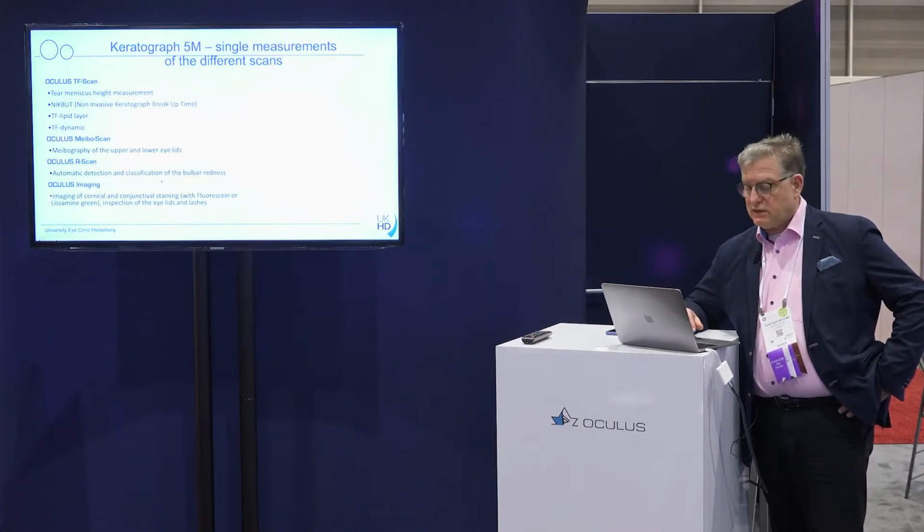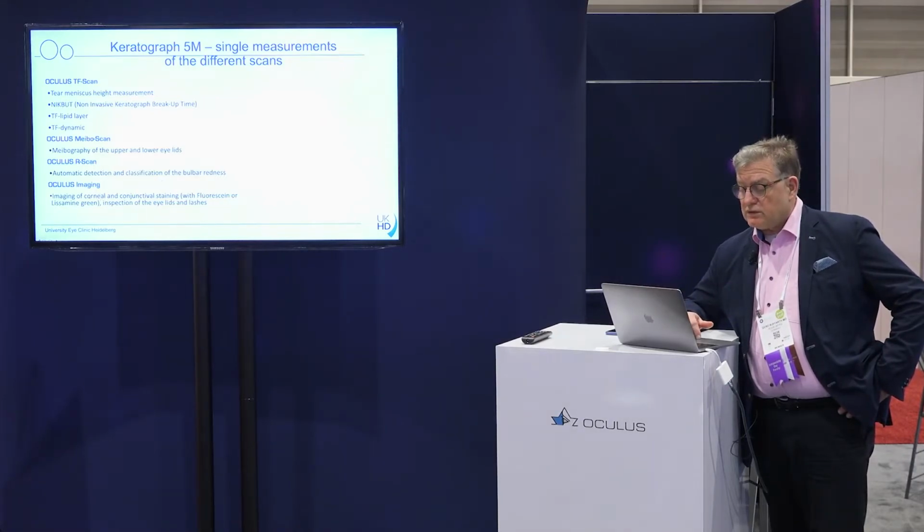So we can measure the tear production, the meniscus. We can do a non-invasive breakup time. We can check the lipid layer and the dynamics of the tear film. We can do a meibography of upper and lower lid. We can also look at the red scan, as how the bulbar redness is. And we can also look at corneal and conjunctival staining.